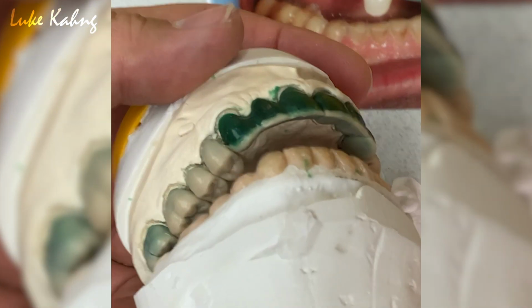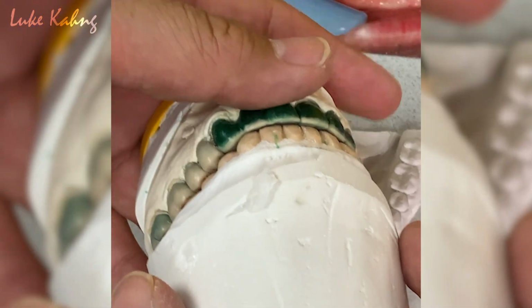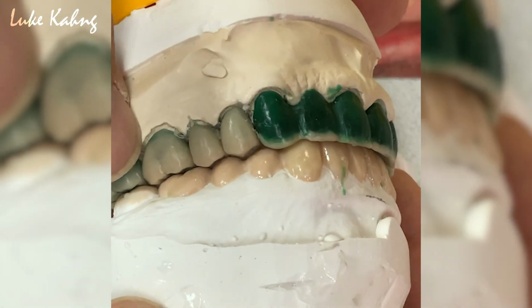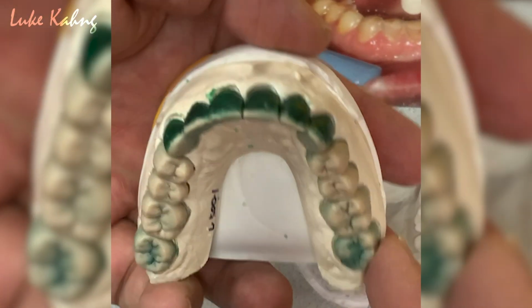So we're mounting it just like that on both, and we set up here. We're trying to close, but it will be slightly open here. And this is the monolith we made. We're going to finalize this lower after we finish.